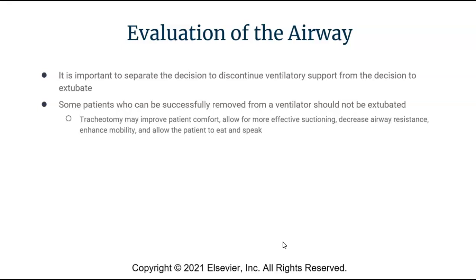Some examples of this might be, you've had a patient that's been intubated because they weren't able to protect their airway, and due to like upper airway swelling or something like that. They might not need the ventilator, but they still need that ET tube, because if they pull the ET tube out, the swelling in their airway will close their airway off again, and you'll wind up in the same boat where they don't have a patent airway and they need to be reintubated.